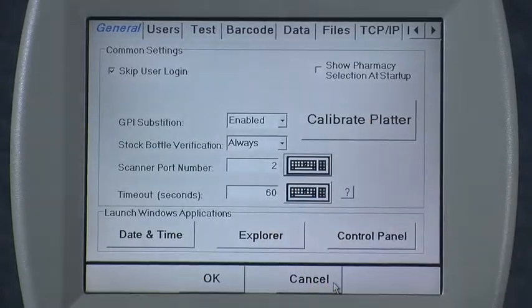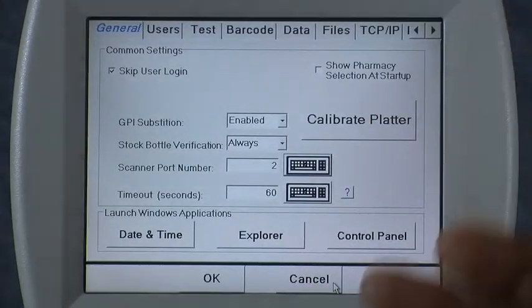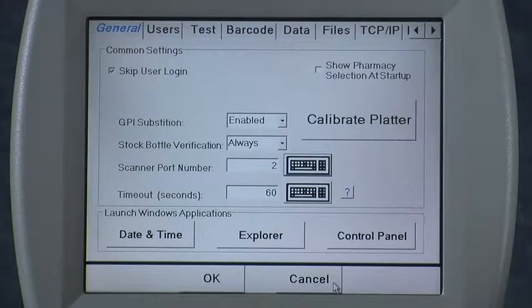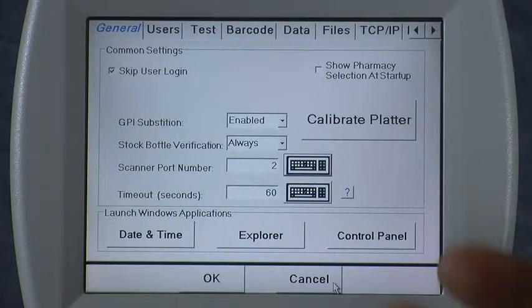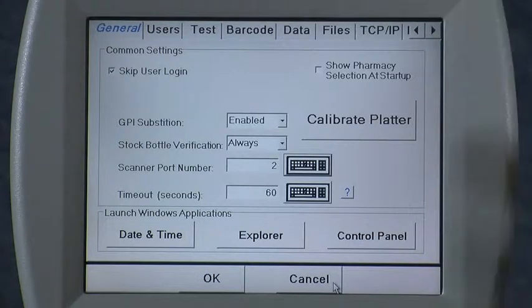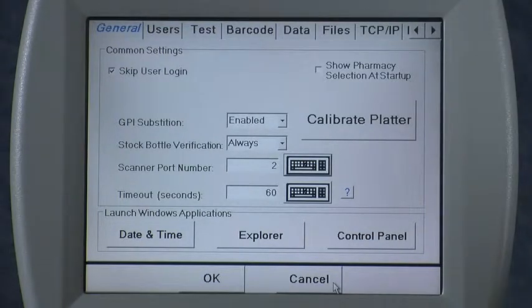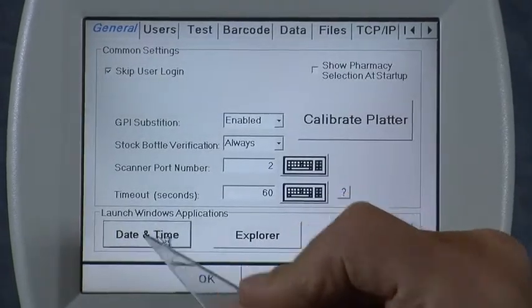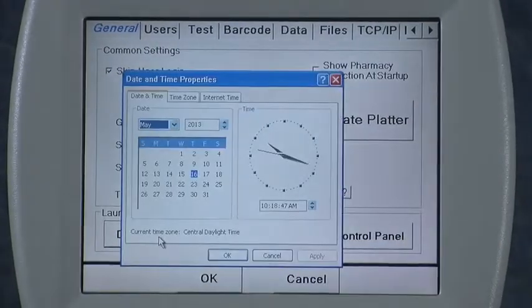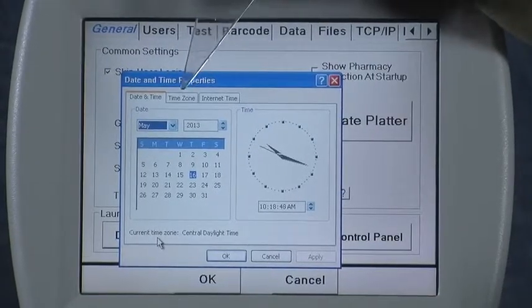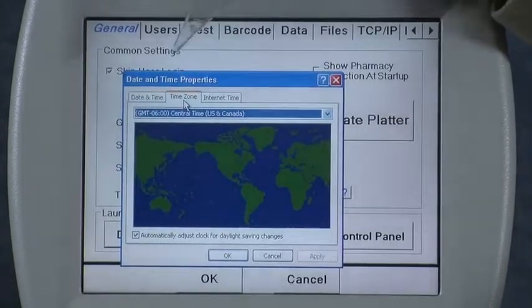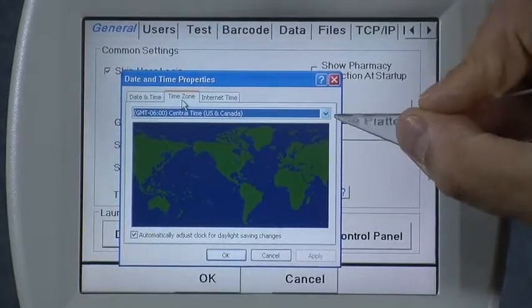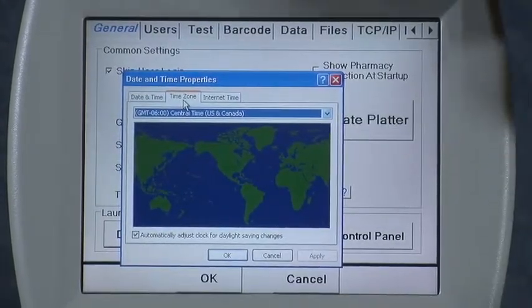Timeout is only useful in the count-only mode. If you leave the icon with no pills on the tray, it will timeout and return back to the main menu. At the bottom of the screen, we have a few selections, the first being the date and time setting — select that, and you can select your time zone by choosing it from the drop-down menu.